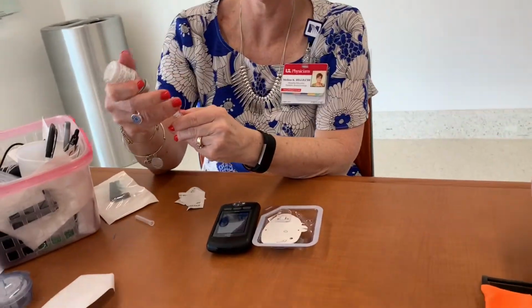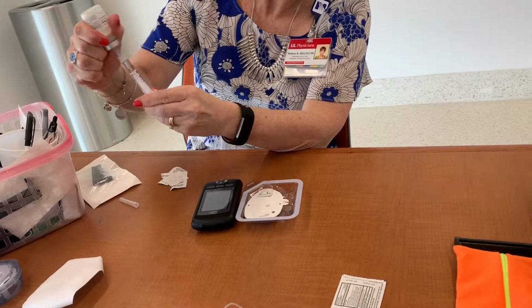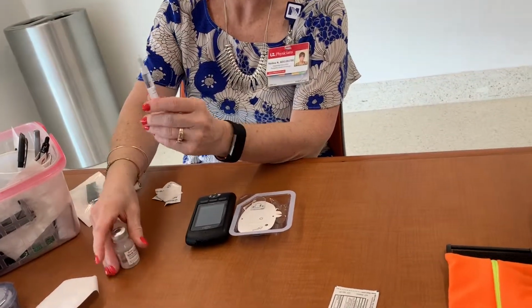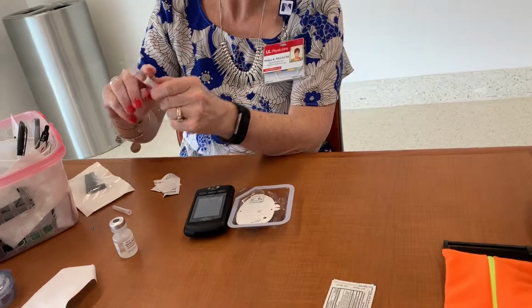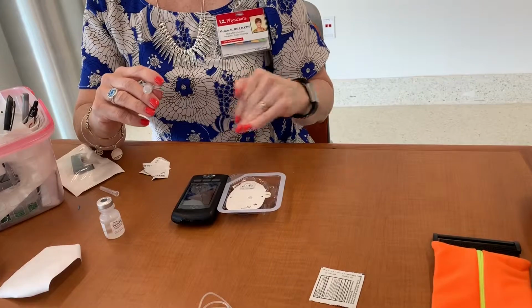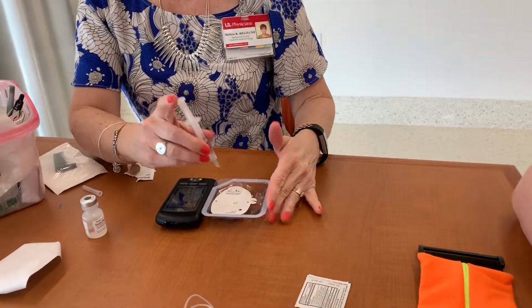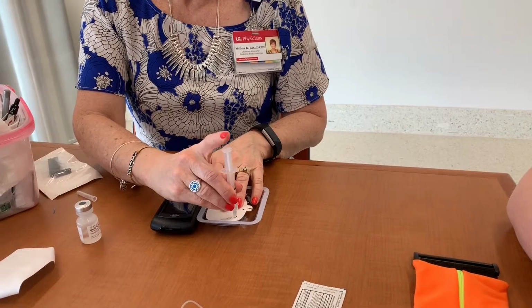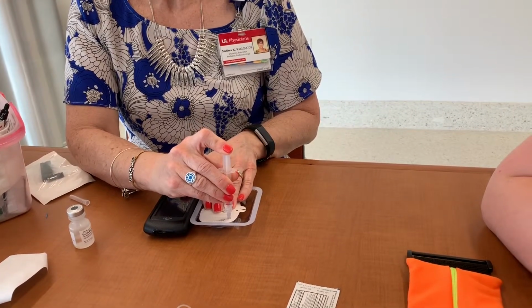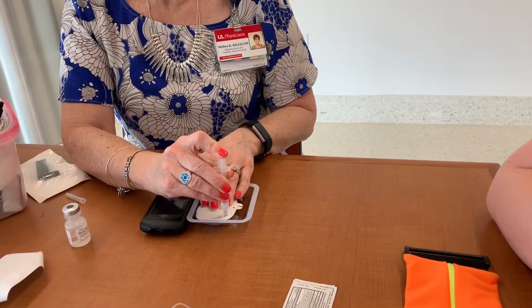Sorry, he's always worried about bubbles. Do we need to worry a lot about bubbles, or does it just do the job like you do with the pen? Yes, and if there are little bubbles, once we hit next, it does an internal priming, so it kind of goes through and gets rid of all of that. Okay, cool. And bubbles in insulin, they're not going to hurt you. It just takes the place of insulin, so it can make your blood sugar a little higher. It's not like bubbles in an IV.